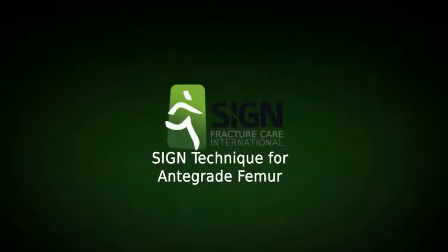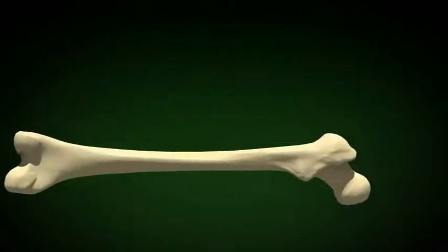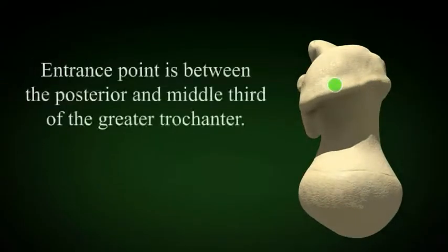The SIGN technique for antegrade femur is shown in this animated video. The approach to the bone entrance is listed on the screen at this time, and we've gone over that in the technique video. We use the trochanteric approach. The entrance point is between the posterior third and middle third of the greater trochanter.